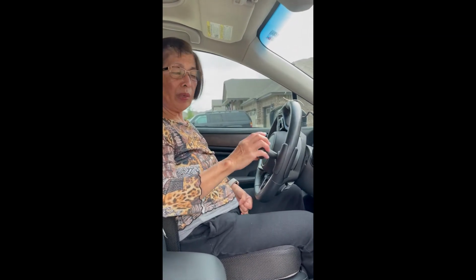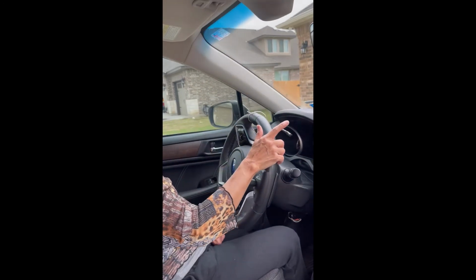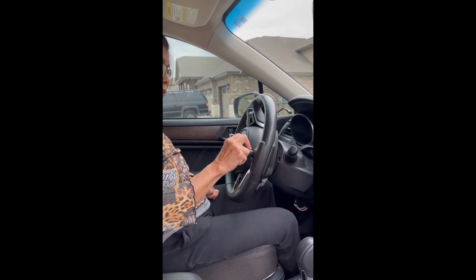How it works? This is the spinner, and since my right arm is the only thing that functions well, better than the left, I should say, I use the spinner, and then this one is to control your left and right turn signals. Can you move the steering knob a little bit to show them how it works? Or is the car kind of locked, isn't it? Perfect. Well, thank you so much.